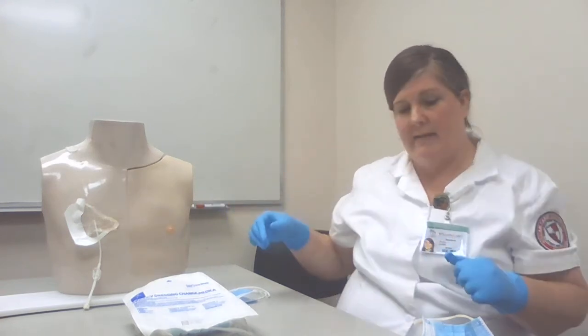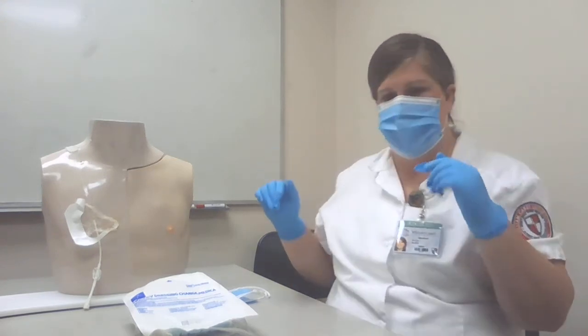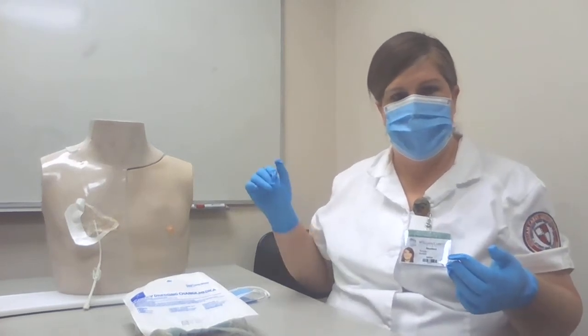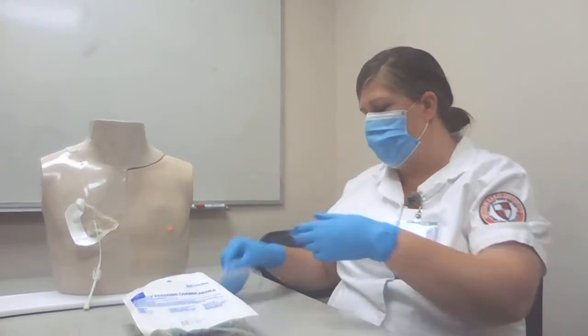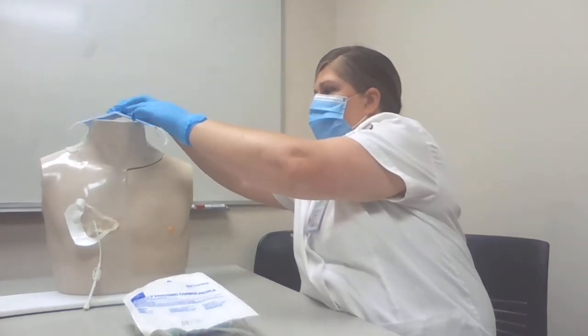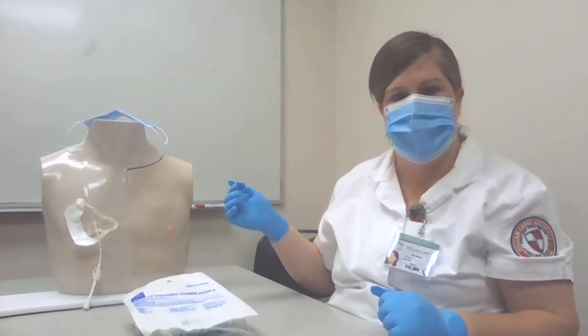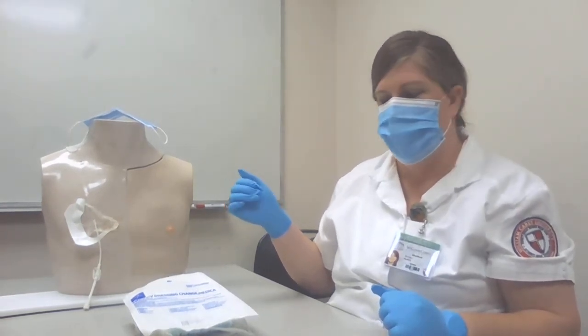Okay, next I'm going to put on a mask, and if my patient was unable to turn their head, I would actually provide a mask, or I'd ask my patient to turn their head away from the insertion site due to contamination.